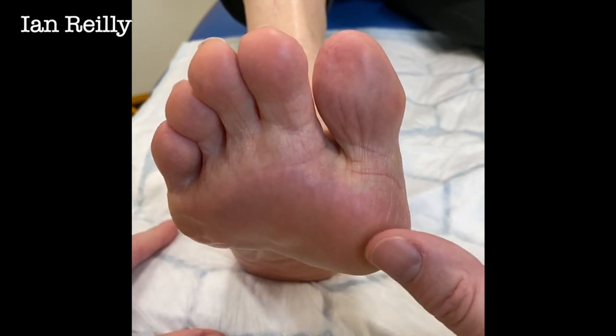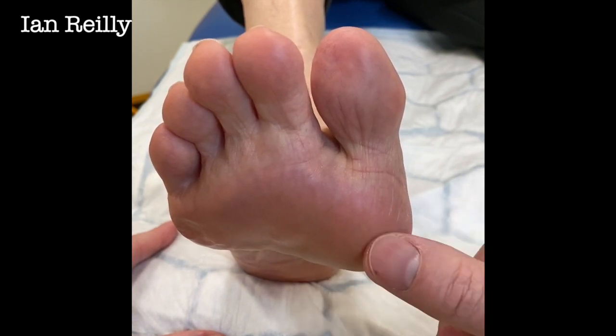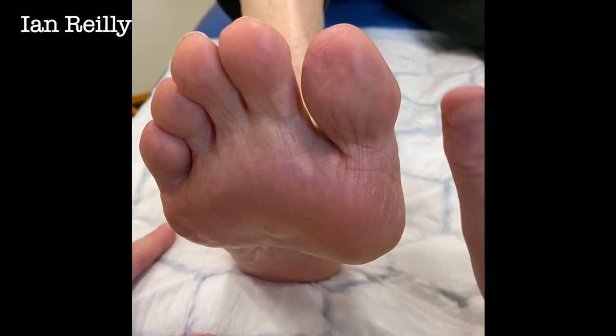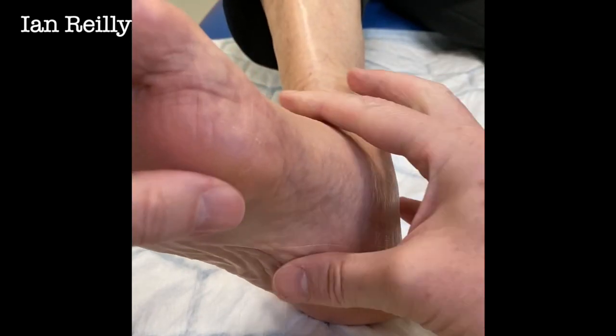What he's doing is hitting down heavily. He's come through really for a surgical opinion as to whether we can take this bursa out. I can do that, but if I take this bursa out it's going to grow back unless I do something to dorsiflex the first ray.